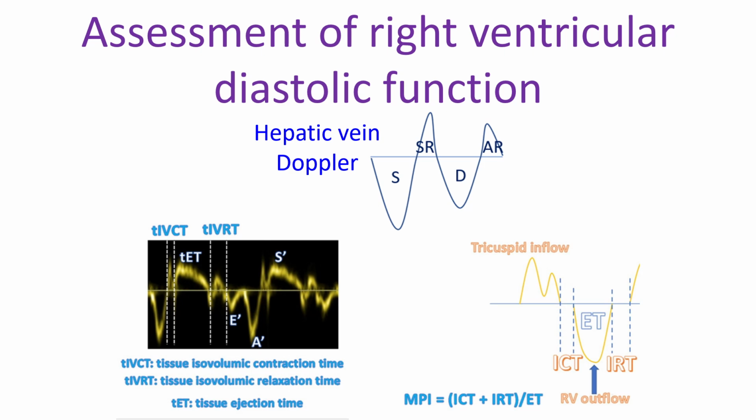Assessment of right ventricular diastolic function is often done by echocardiography, though not as commonly as for the left ventricle. An RV-focused apical four-chamber view is used for the assessment of the right ventricle. In the RV-focused view, the transducer is adjusted from the standard apical four-chamber view to have the right ventricle in the center of the image rather than the usual image centered on the left ventricle. The left ventricular outflow tract should not come into the view and the left ventricular apex should remain at the top of the image sector. In this adjusted view, the entire right ventricular free wall should be visible.